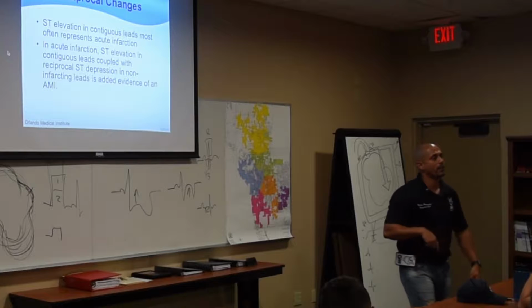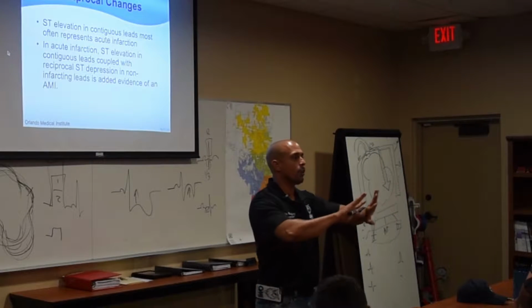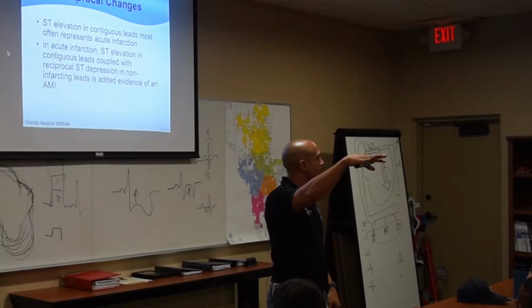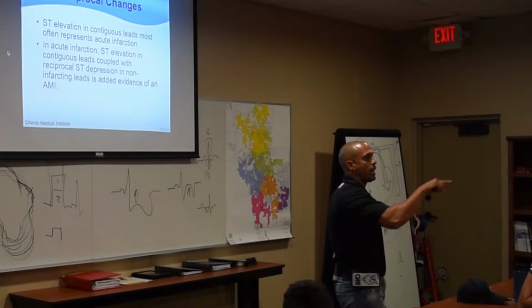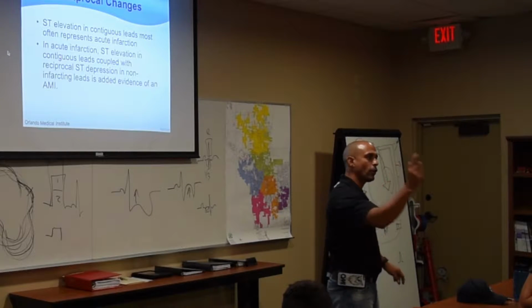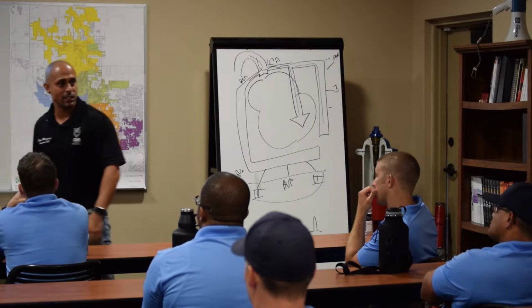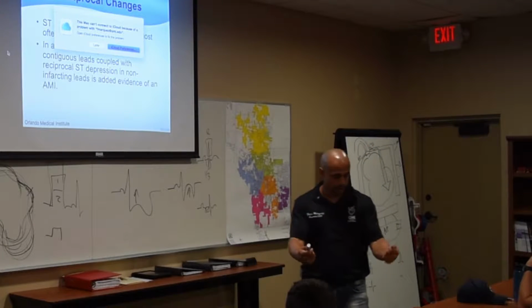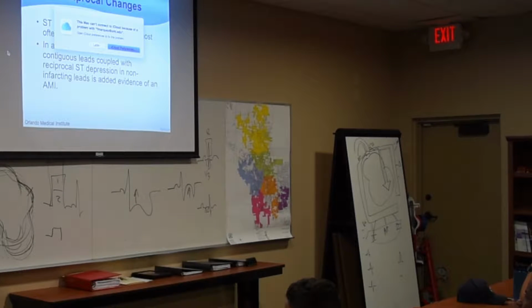Do you know LifePak 15s? If you put a 12 lead on correctly, do a 12 lead, don't shut it off. Leave it on for the duration of the patient. If any of his ST segments change from his first initial one, it automatically prints a 12 lead. If it prints a 12 lead, it means it's recognizing ST changes, so look at it, okay? If you keep it on. All right, everybody's good with reciprocal changes?